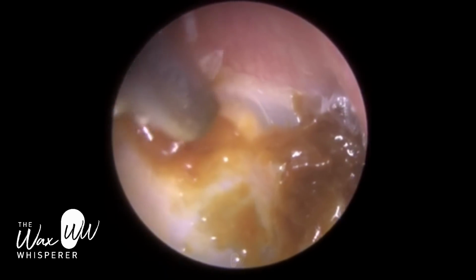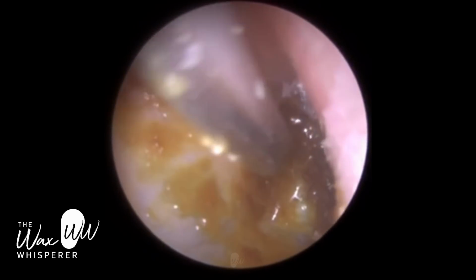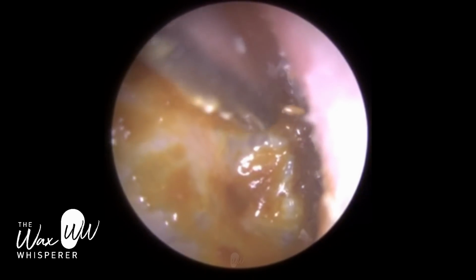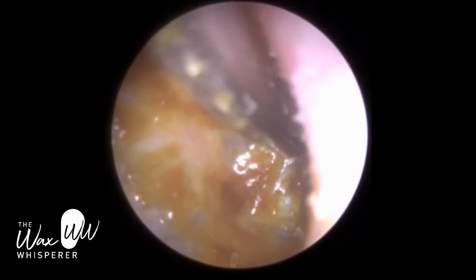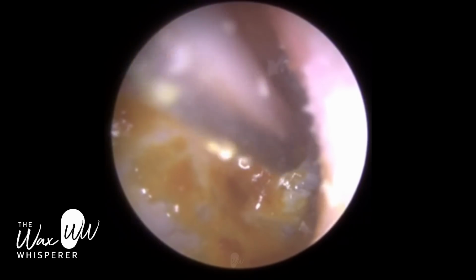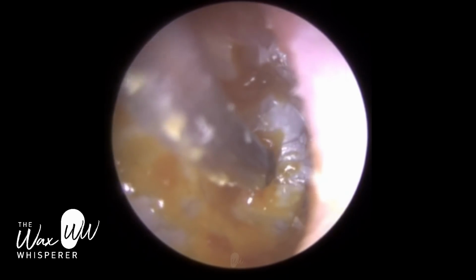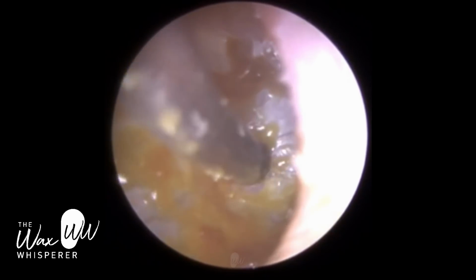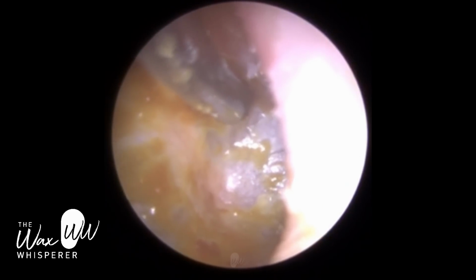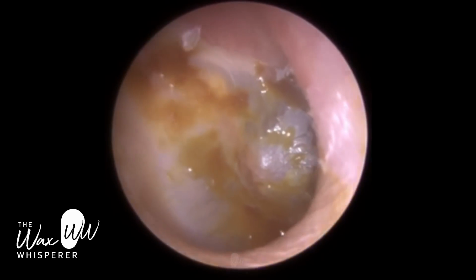This is the view we can get with an endoscope. It's very hard to achieve the same view with an otoscope, head loupes or microscope. And I'm using a fine ear gauge, and I've just bent the tip so I can get access, and it's just an amazing view. These types of procedures probably appeal more to the audiologist because it's more of a technical procedure. In terms of viewing pleasure, I'm not sure. You can tell me as a viewer how good it is, but from a technical point of view, I really enjoy these types of videos because it's a bit more technically challenging.